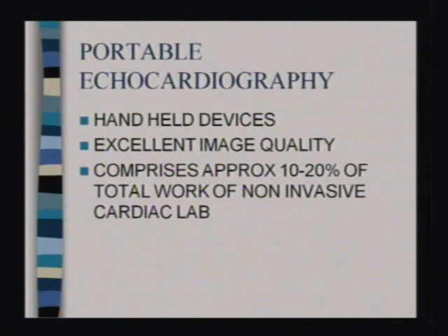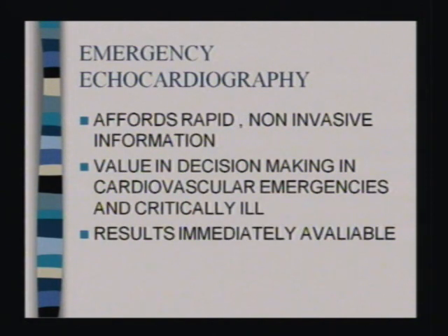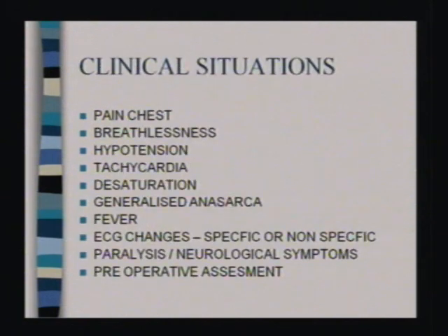Now, going further on, as we are talking so much about emergency, we have a portable machine now. We have very good portable machines which are handheld devices with excellent image quality, and these comprise approximately 10 to 20% of the total work done in the non-invasive cardiac lab. So what is the use? Emergency echocardiography gives you rapid, non-invasive information. It gives you value in decision making in cardiovascular emergencies and the critically ill, and the results are immediately available.